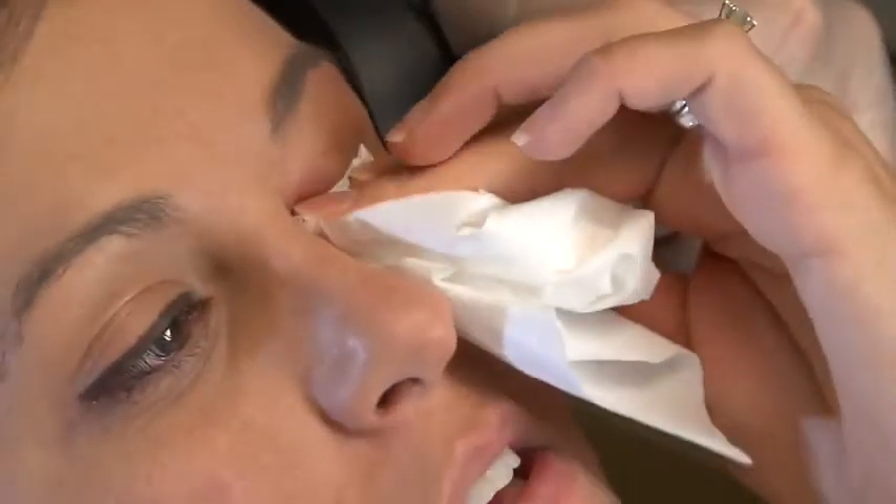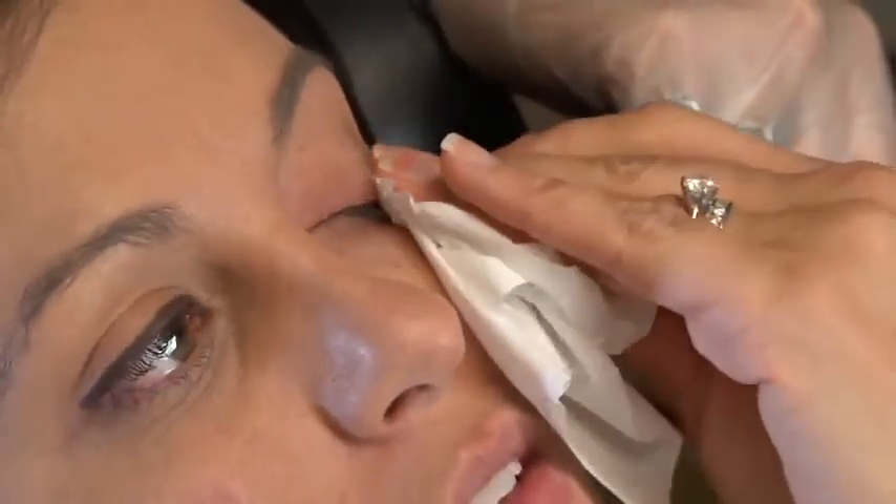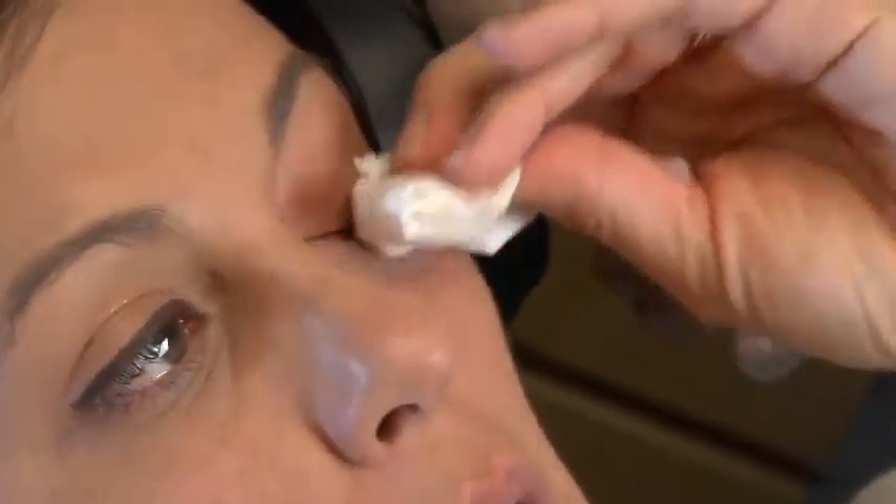If the patient is wearing contacts, they will need to remove them. Also remove any makeup around the eyes to ensure proper heat absorption.